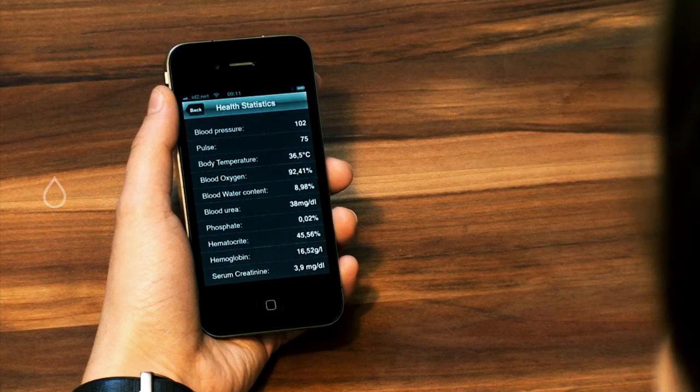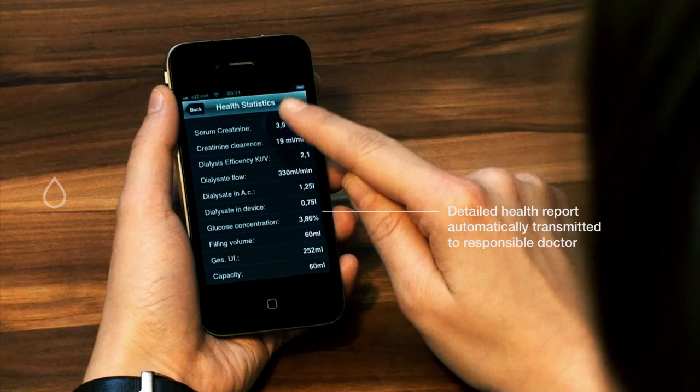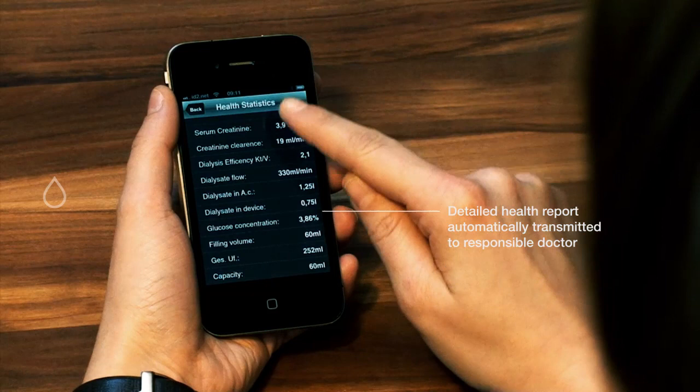To see the health statistics, just click on the button at the bottom of the page. A detailed report is transmitted to the responsible doctor after every completed dialysis session to help maintain accurate and informative records.